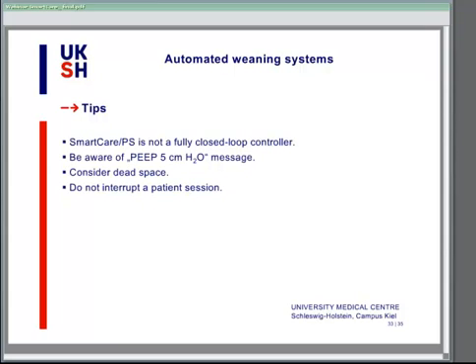Some tips for the practice if you want to use SmartCare on your patients. The first thing is that SmartCare is not a really fully closed-loop controller. So you have to care about all the other ventilatory settings: FiO2, PEEP, the pressure slope, for example.